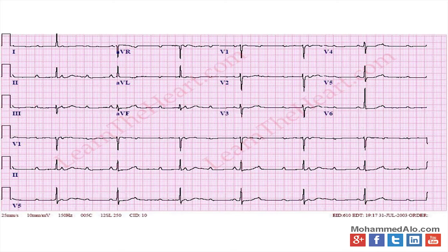The next EKG here, if you follow this pretty closely, you see P wave, QRS, P wave, P wave, QRS, P wave, QRS. It's kind of confusing, hard to tell. If you look at all the PR intervals, they don't all match. No two PRs on the rhythm strips seem to match each other. This person is in a complete heart block. You've got the P waves that kind of march out okay, and you've got this escape rhythm coming from the junction, or junctional escape rhythm, because it's narrow, at about 40 beats, or maybe even less than that per minute.